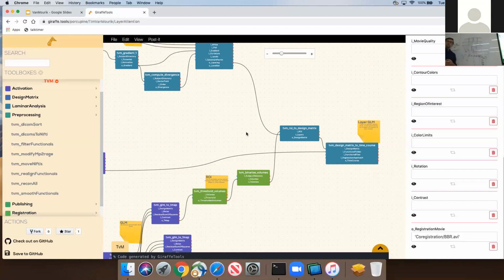Yeah, absolutely. So if this grid, well, clearly, if you go towards infinite resolution, so very, very tiny voxel size, then every voxel is only in one layer, and thereby you only have ones and zeros, and then you've got an orthogonal matrix, and therefore no collinearity, and thereby a perfect estimation.